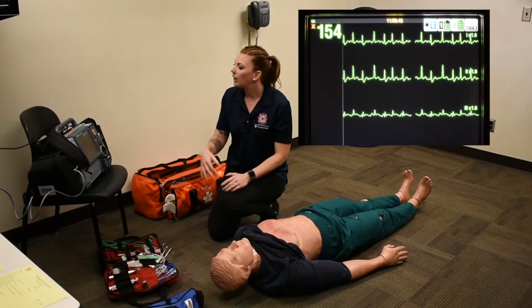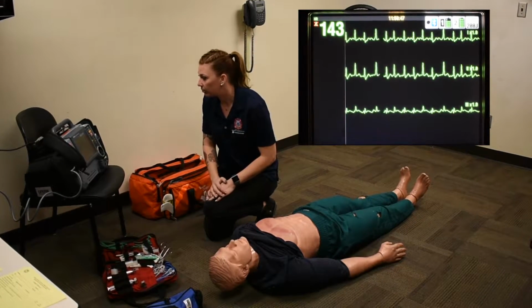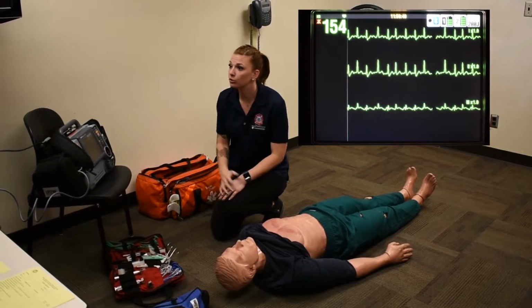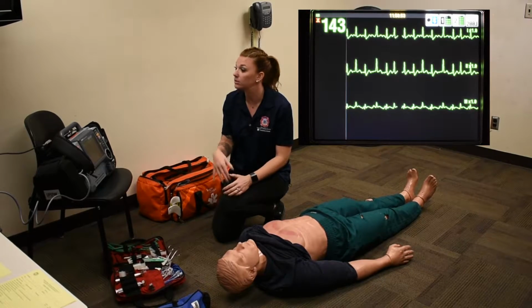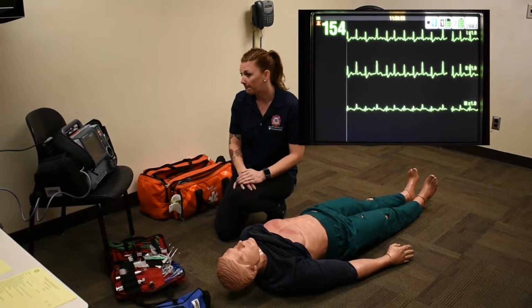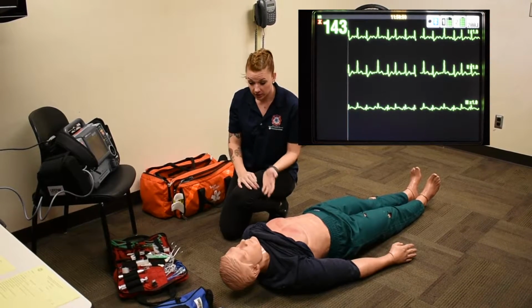Okay, since I already have my blood pressure and other things, and since my patient stated he has chest pain, I wanted to do my 12 lead, which looks like it's showing AFib with a rate of 140 at this time, to rule out any signs of ischemia, acute ischemia, or any depression even in my 12 lead. Ischemia or infarct, I apologize. No, there are no indications. There are none? Okay.